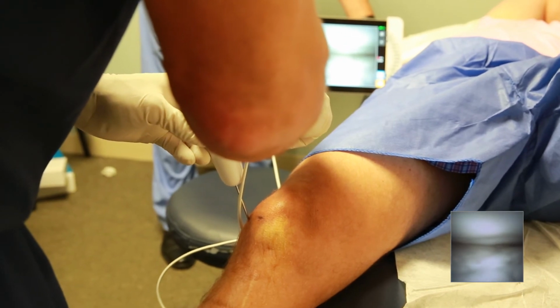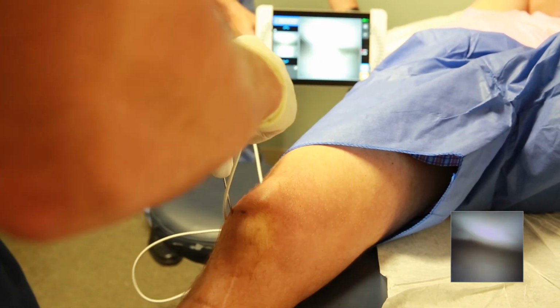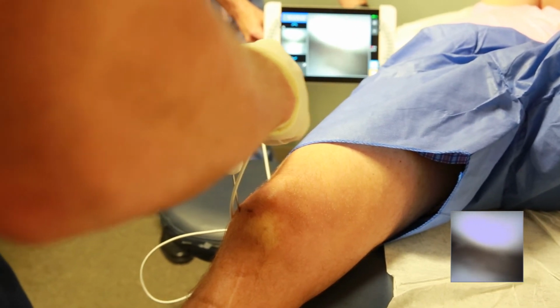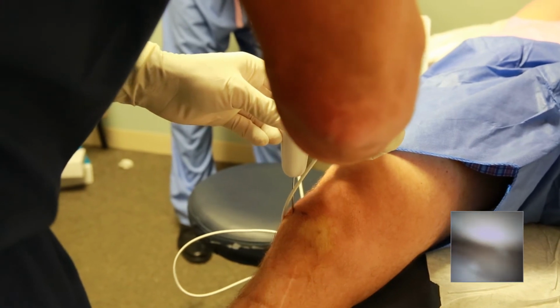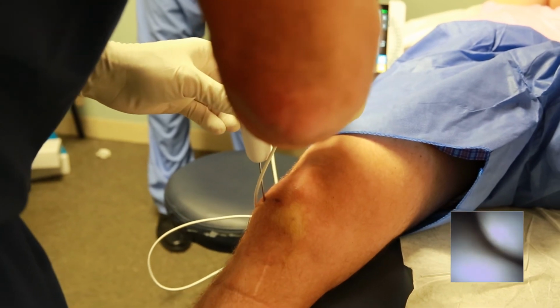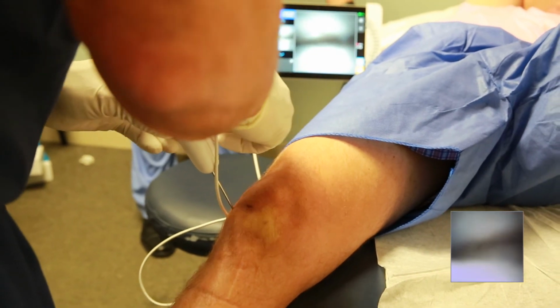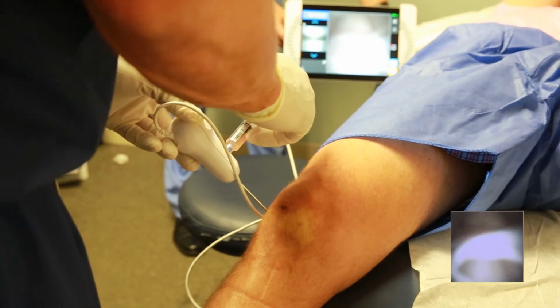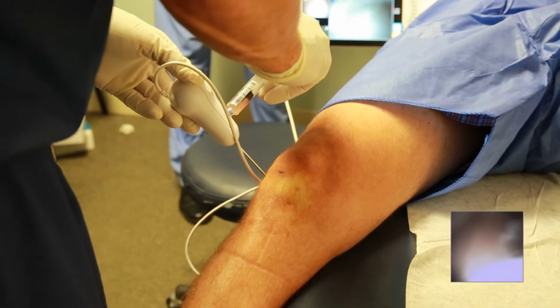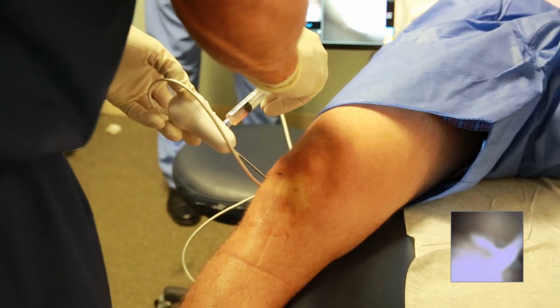Once we get in here, we have wear, and you can see that chondrosis right there. So you've got a fair amount of arthritis there, Jason, on the lateral aspect of your knee. Your meniscus is in pretty good shape in the front. Okay. And then back to your ACL, you get a really good picture of your ACL there. ACL's intact, looks good.